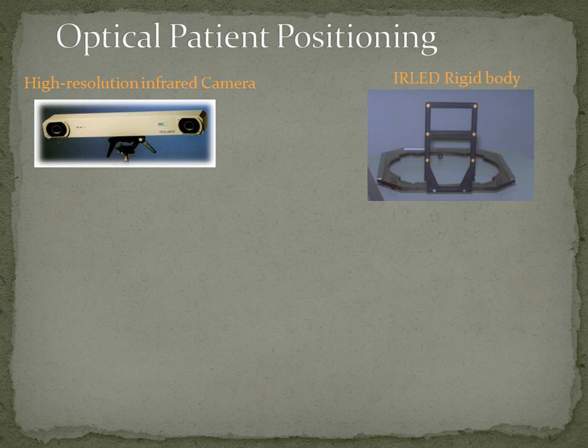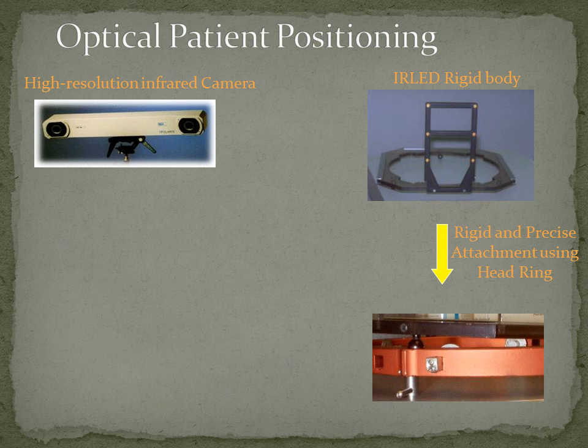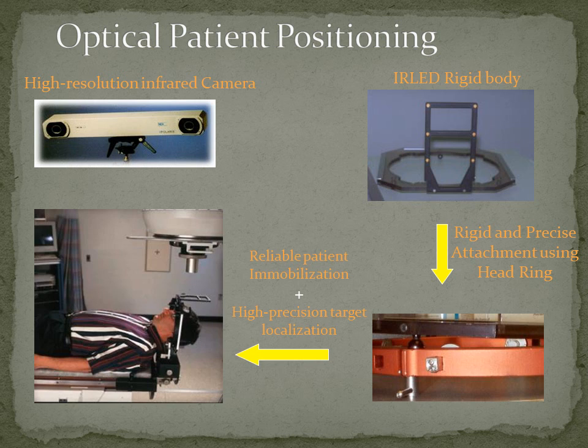There are other systems that we've developed over the years to actually allow us to put patients into position. Some of these are very similar to the ones we use in the OR. There are optical cameras similar to the systems we use in Stealth and Stryker in the OR now. It's testing that one. And these systems actually lock into the head ring just the way the localizers do. And it's just showing you locking the reference into the head ring. And then they go on the table, and then we can straighten up the patient and the table in the system.